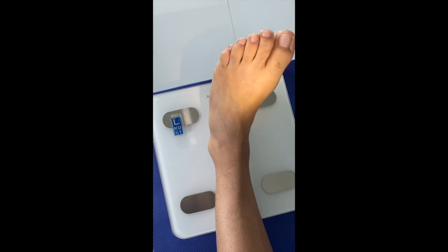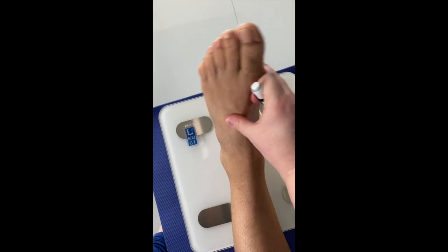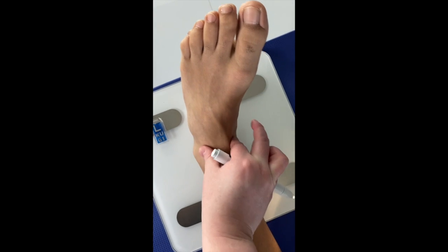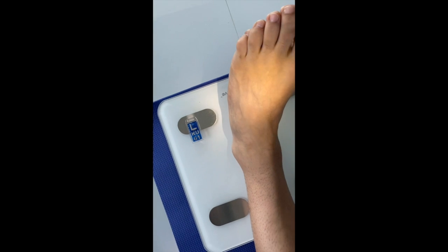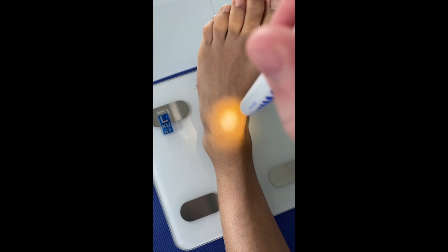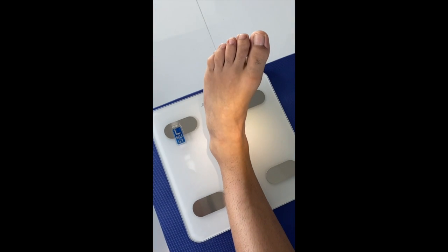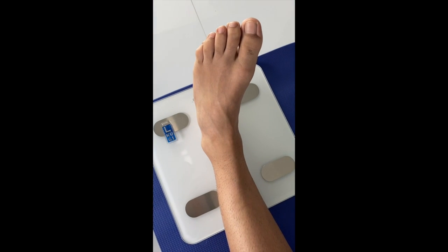For the AP mortise, our patient is going to be supine or seated on the table. You want to make sure that they rotate their foot internally 15 to 20 degrees so that the intermalleolar line is parallel to the tabletop. And your central ray is going to be perpendicular midway between the malleoli, right about here. It's going to be taken at a 40 SID, and we will be using a 10 by 12 cassette.